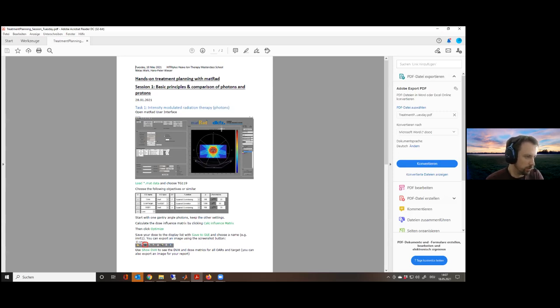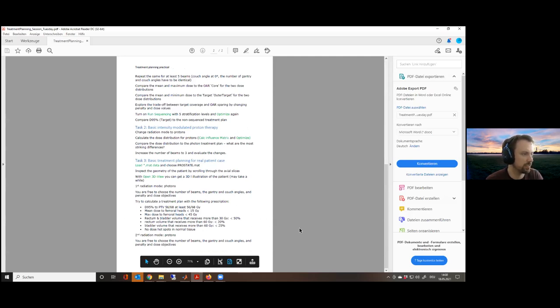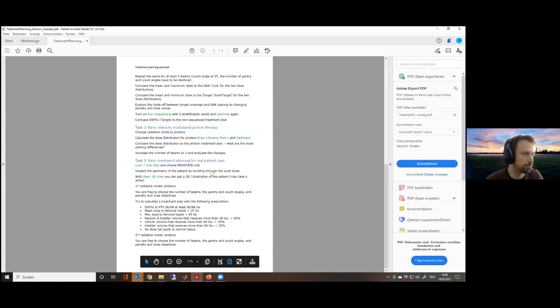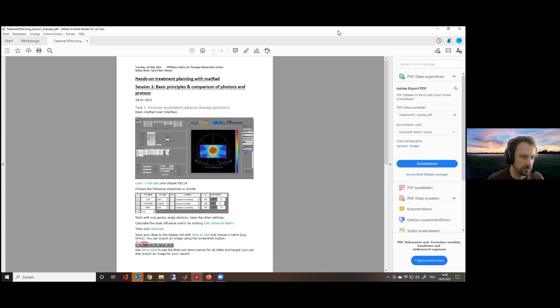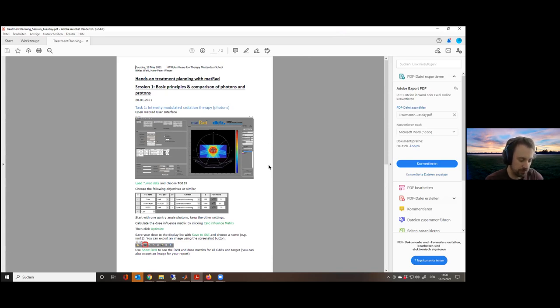Our job is not to make you treatment planners — our job is to let you understand how it works at the core. We will first start with very simple photon treatment plans, then do simple proton treatment plans, and then go to a real patient case and try to fulfill some prescriptions. During the practical, I will work with the MATLAB environment from the code.